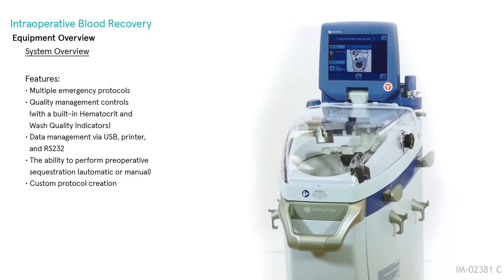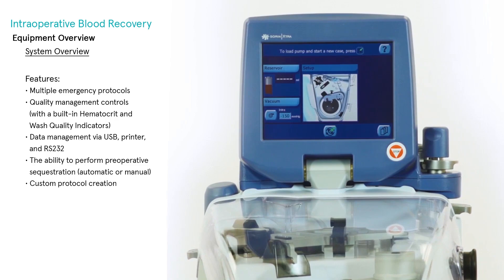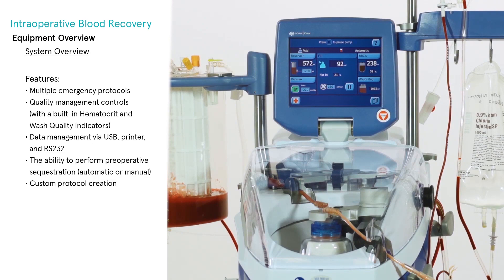LeivaNova Extra is an ergonomic and robust auto-transfusion system with a user-friendly interface, developed by the same designers of the heart-lung machine, S5. Customers appreciate the Extra for its unique combination of equipment features.